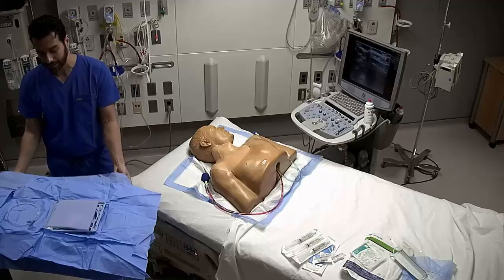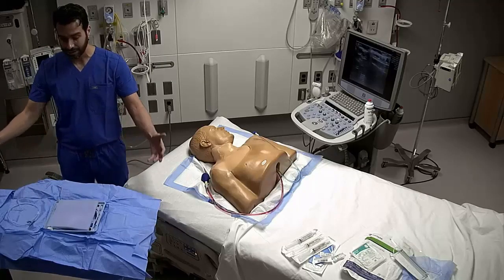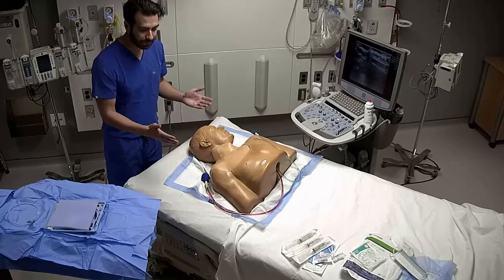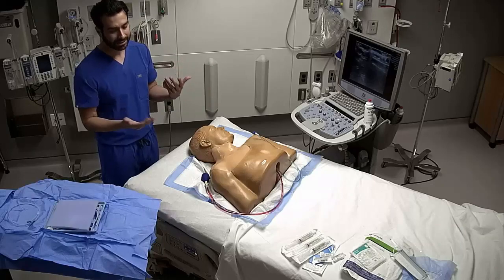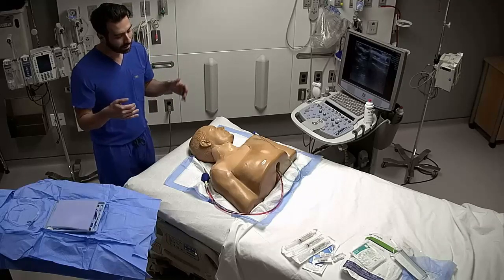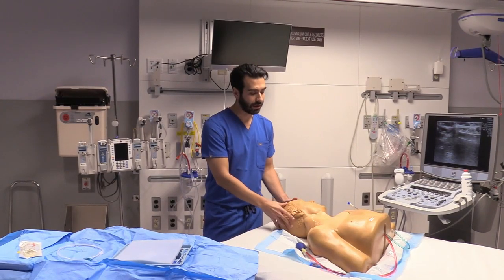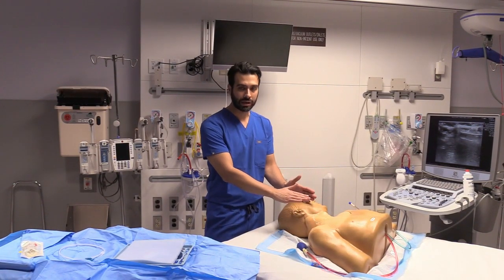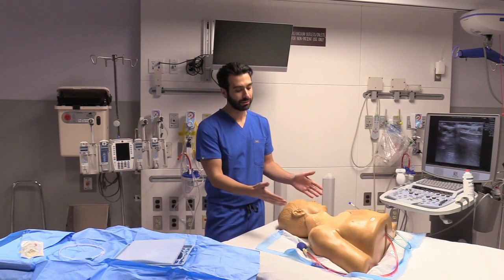I would open up my tray here and then kind of have everything available immediately to me. I would lay the patient flat. Sometimes people put people in Trendelenburg to make the IJ a little bit larger. One of the mistakes I think that's made is an aggressive head tilt towards the patient's left. Sometimes we'll move the carotid underneath the IJ and cause it to be posterior to it.